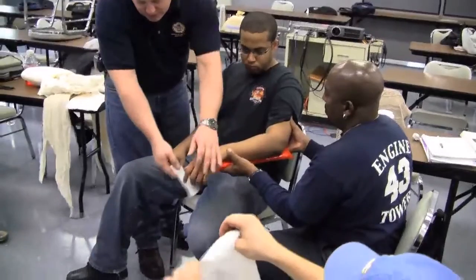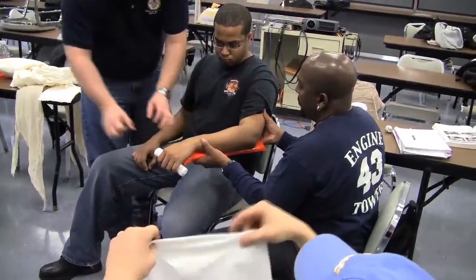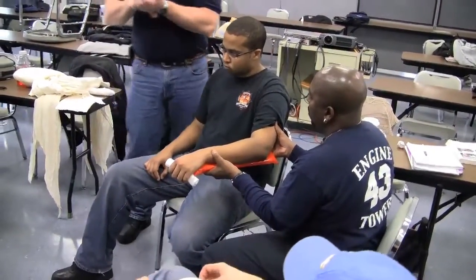He's going to support the splint in the arm. We'll put this in the patient's hand, just let him hold that. That's just going to make it easier for him to keep that natural position.